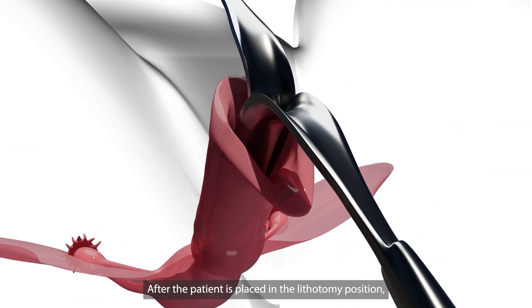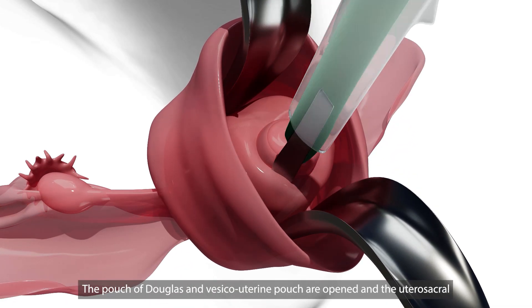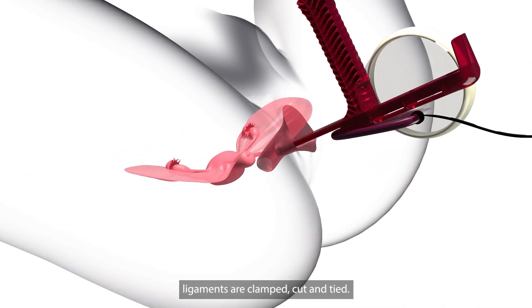After the patient is placed in lithotomy position, a circumferential incision is made around the cervix. The pouch of Douglas and vesico-uterine pouch are opened, and the utero-sacral ligaments are clamped, cut, and tied.